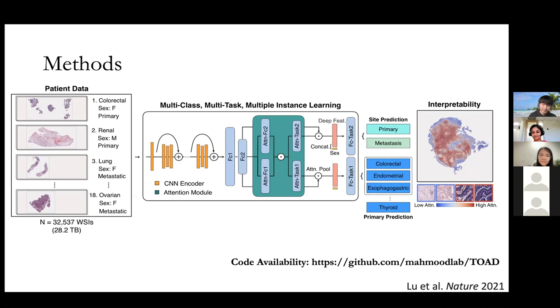Yeah, thanks so much for the very insightful comments. I agree that moving forward, the field might want to think about not just relying on fixed features extracted from a pre-trained encoder, but also finding a way to actually backpropagate. There have been methods that can backpropagate to the individual pixels, and that might be the future for this field.